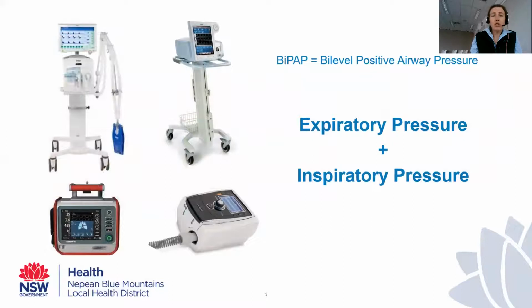So there are a number of machines that can deliver this therapy. Some of them look quite fancy and have lots of buttons, and some look more basic, but fundamentally they all deliver the same therapy. There are some pros and cons to different machines, but again, they're all going to deliver the same therapy. So BiPAP is a bi-level positive airway pressure. We are delivering a pressure during both the inspiratory and the expiratory phases of breathing.